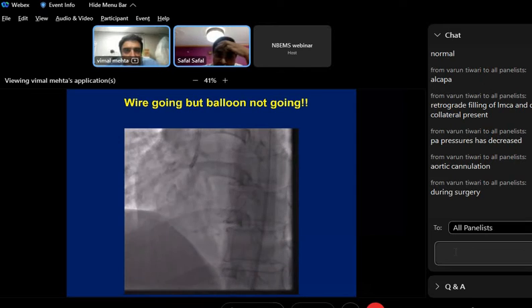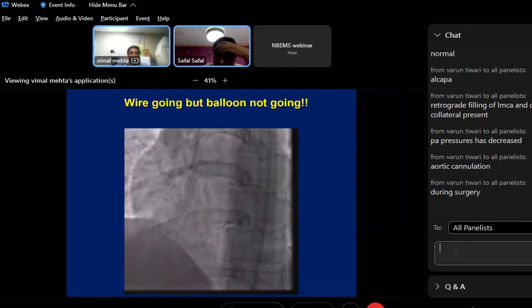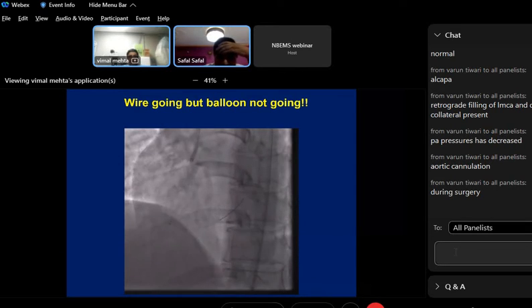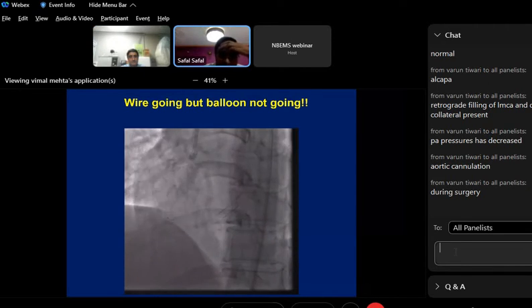It appears that most of them have not heard of this kind of catheter or seen it. No, not less support. The disadvantage is that it gives you a false sense of security. Even when your tip is actually wedged, it may show you good pressures. And if you carelessly inject there, your whole artery will get dissected. So the wedging is not clearly manifested on the pressure waveform. It may falsely show you a normal pressure waveform.